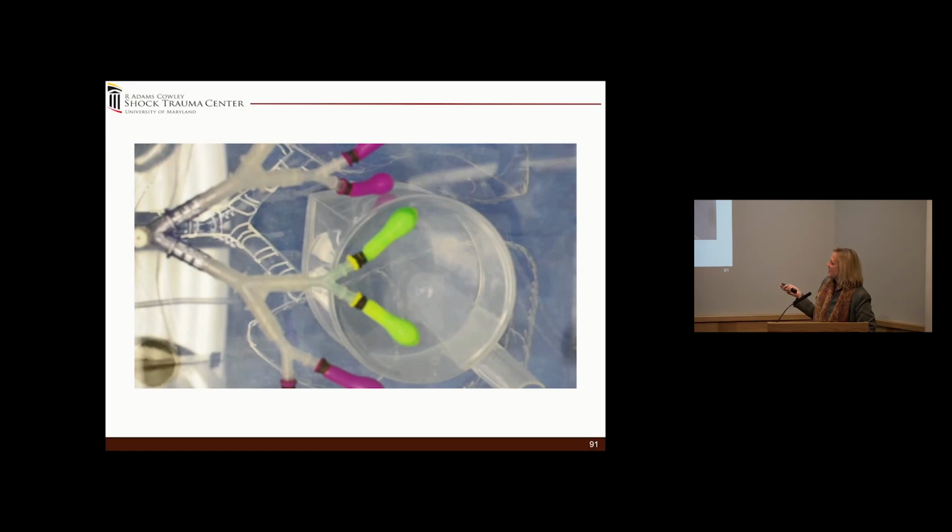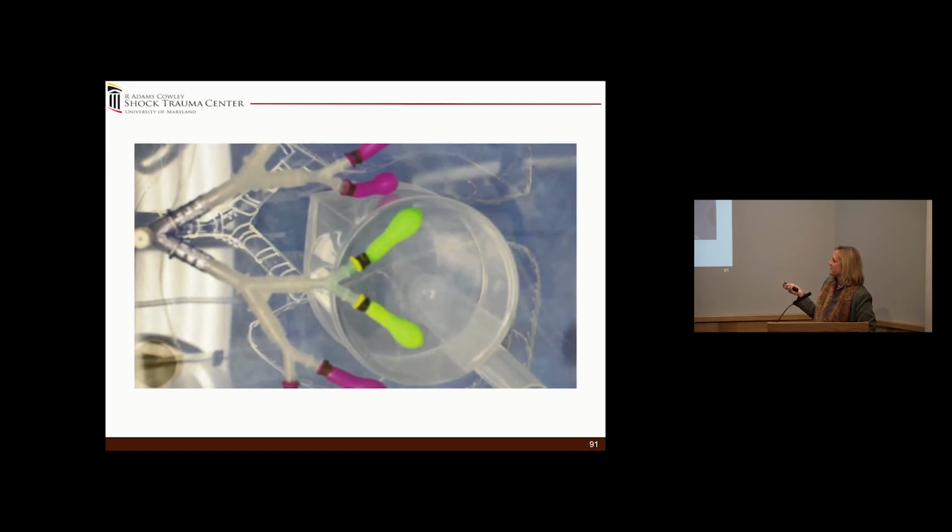So the same amount of time, within about 3 to 4 breaths, the balloons are empty. Completely empty. Where did it go? Look at the bronchial tree. And this is what happens a lot of times when you switch over to APRV, that all of a sudden all these secretions start coming up the endotracheal tube. And that's actually what we looked at.